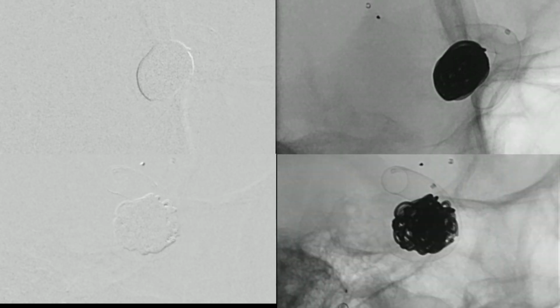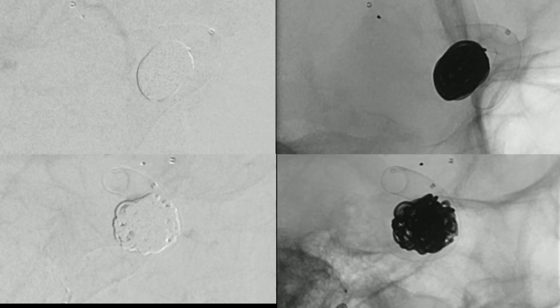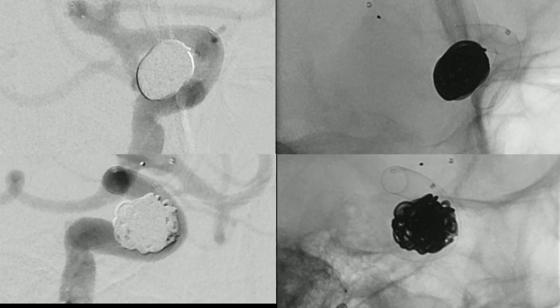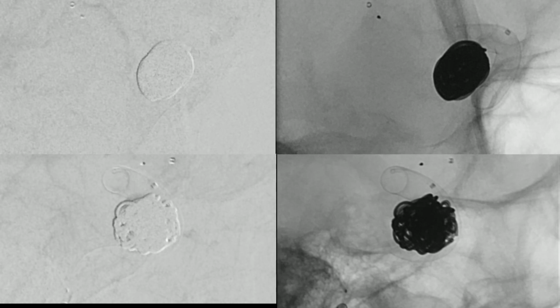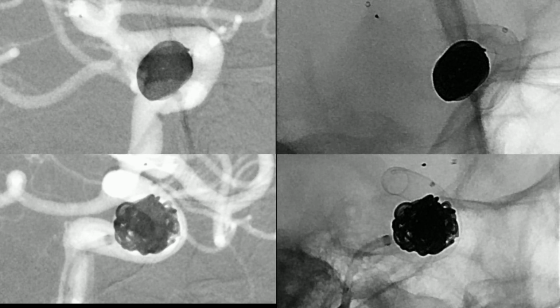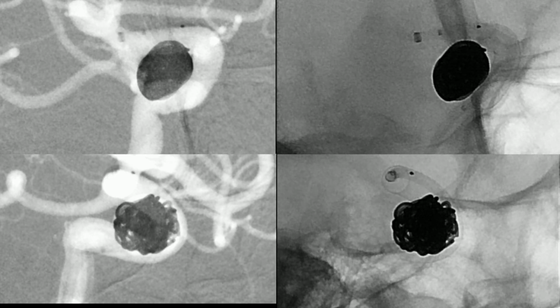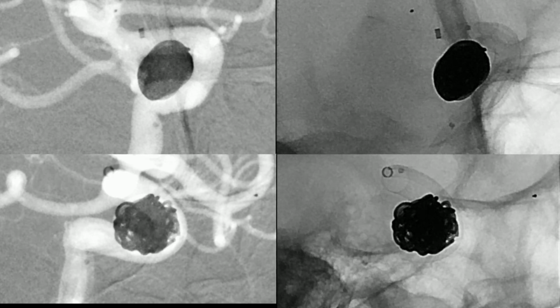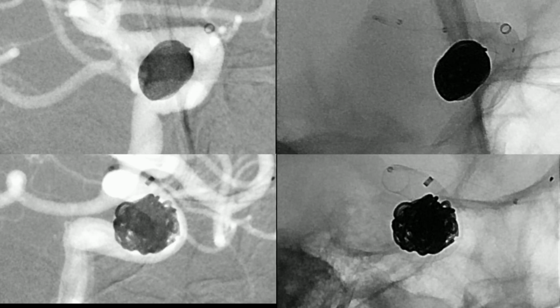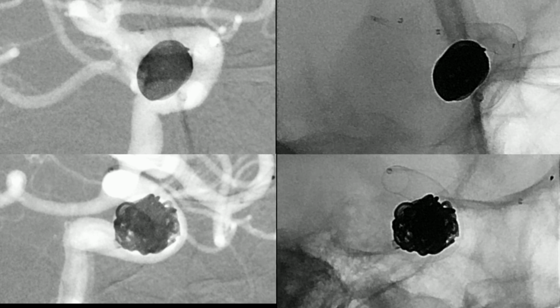And now we need a 2D angiogram to see the results, and as you can see, there is a little bit of distance between the flow diverter and the wall of the ICA, which we will correct using the intermediate catheter Sophia 5F. We push the Sophia catheter carefully through the flow diverter, and as you can see, through this massage maneuver, we can reach a much better wall apposition of the flow diverter, and this distance has disappeared.